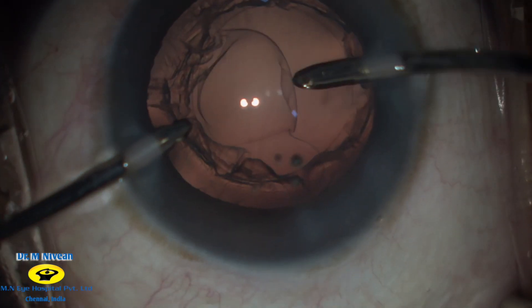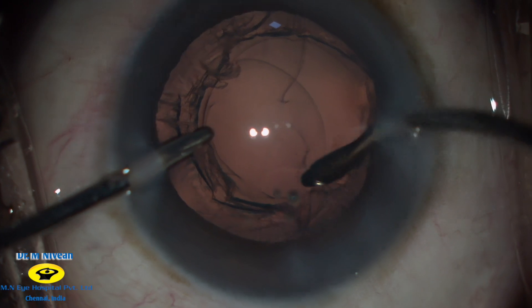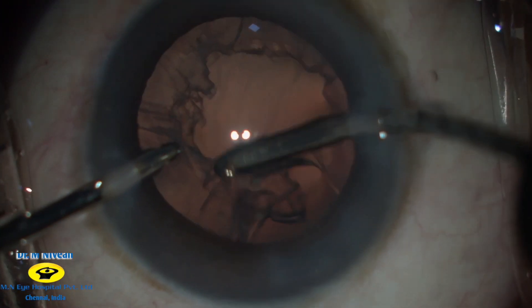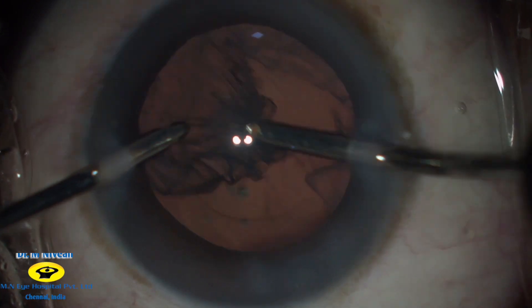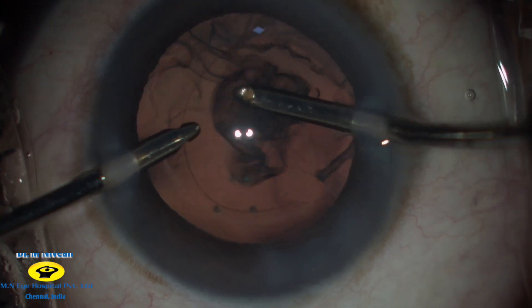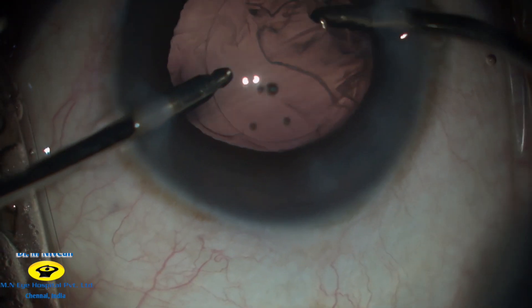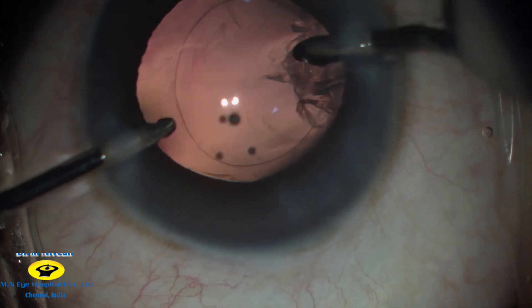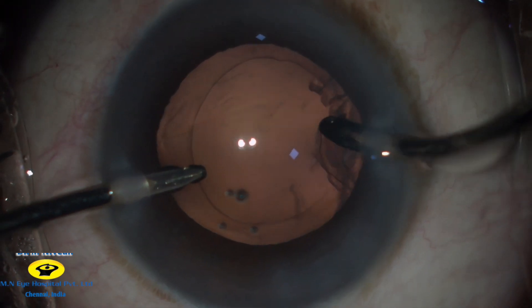Bimanual irrigation and aspiration is then done and the cortical remnants are then stripped towards the centre and aspirated. Since the anterior chamber is well formed, the posterior capsule is pushed backwards, making removal of the sub-incisional cortex easy without switching hands.